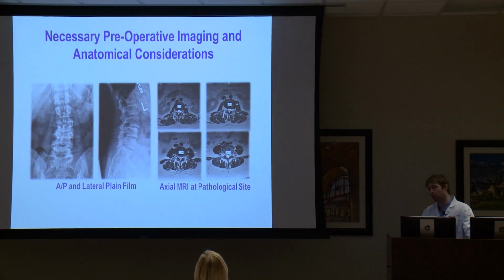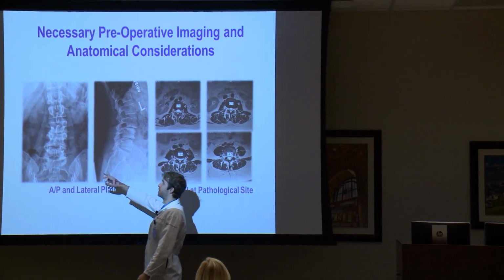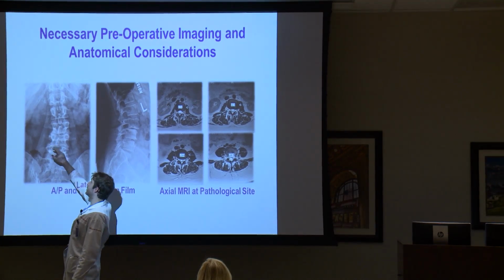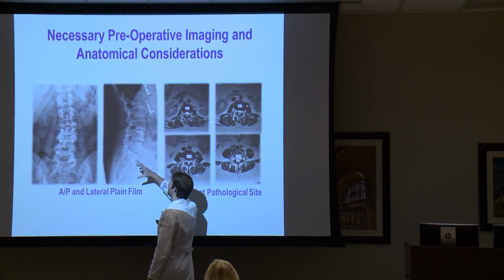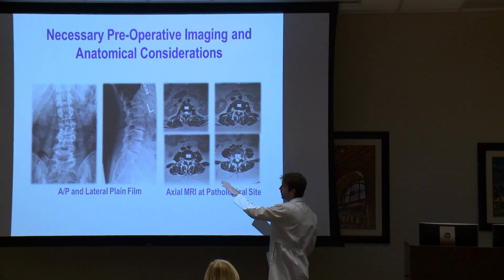And so, things to worry about: not everyone is a candidate for it. You've got to look at your preoperative imaging. On the left, on the x-rays, that's a perfect example of a patient that would do great with this. There's a little bit of a degenerative scoliotic curve. They're kind of breaking down just a little bit. They've lost disc height here compared to this one. You can definitely see the difference in height, and actually here too. And so with the lateral, you can straighten that spine out, and you can definitely give them the space they need. Here's that spondylolisthesis at that level, and you can straighten that out as well. So that makes someone an optimal candidate.